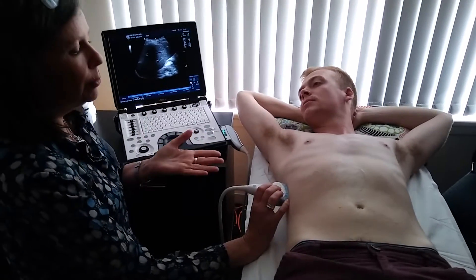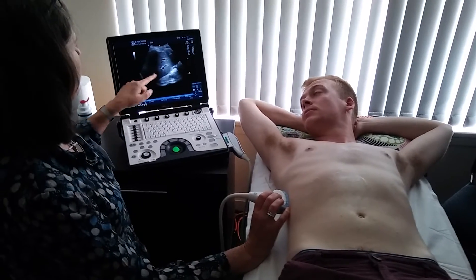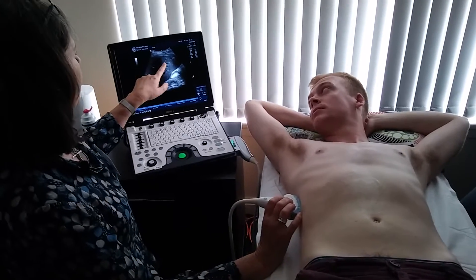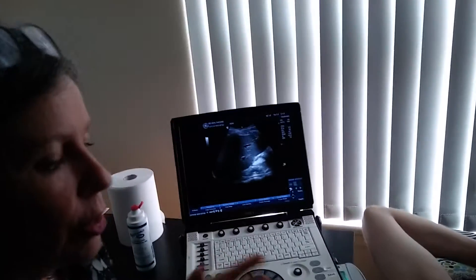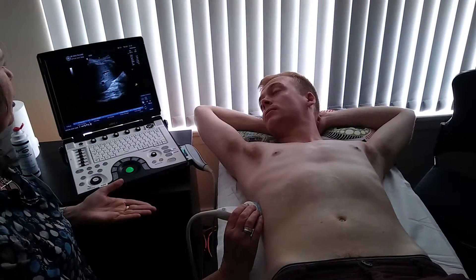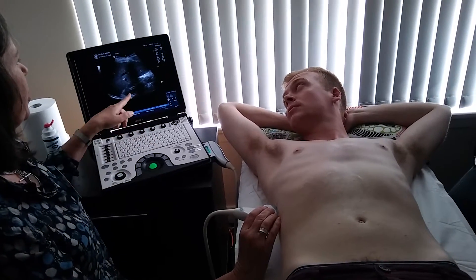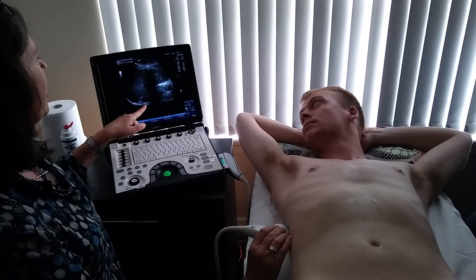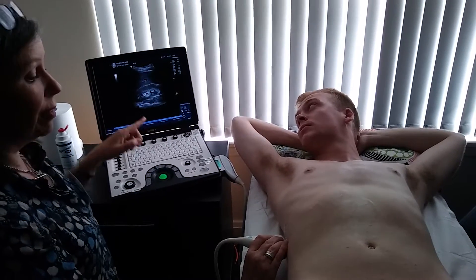I'm a big believer in keeping it simple. So I'm going to look at this picture - can everyone see the liver? Can you see there are blood vessels in this liver? As soon as you see blood vessels, you know you're too anterior. So all I'm going to do is slide my hand posterior. Posterior, posterior. Can you see the kidney starting to come in here? The kidney is retroperitoneal, so it is way more posterior than you think.